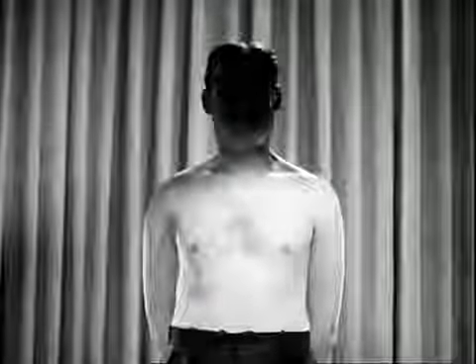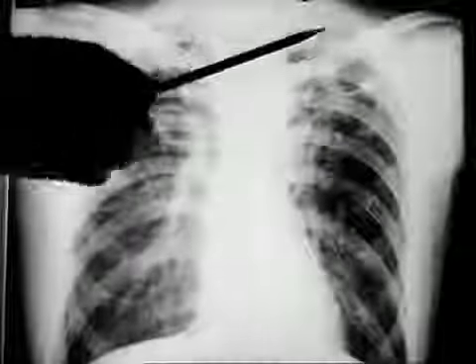This athlete boasted of his great physical strength and belittled his cough and sputum, ascribing it to cigarettes. The X-ray revealed this multiple cavity formation. Without a good X-ray picture, no examination for tuberculosis is complete, and suspected tuberculosis cannot be detected nor ruled out without it. These three procedures are important aids in making the diagnosis of tuberculosis.